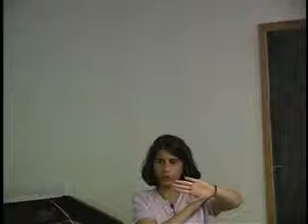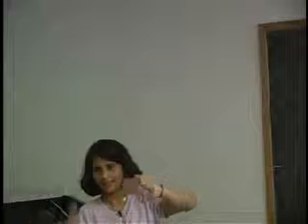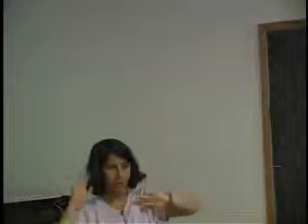I couldn't care less what its intensity was, because in MR it doesn't even show up well. So I took 3 different scans of different patients and created a spatial model. For this cartilage, I measured, if I know where bone is, what is the probability of cartilage being at different pixels? Is that making sense? Yeah, sure. And I modeled that as another Gaussian. I already know where all the bone pixels are. From my previous scans, I figured out that at a distance of 2, 3, and 5 pixels, the probability of being cartilage is very high, and it starts to drop off as a Gaussian. And that led to a whopping number of publications. That was a very simple idea: why don't you use spatial information?